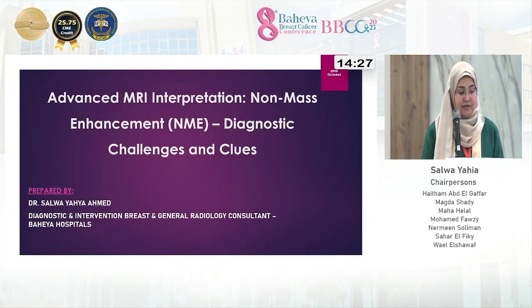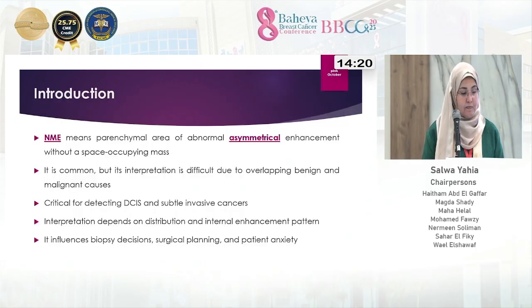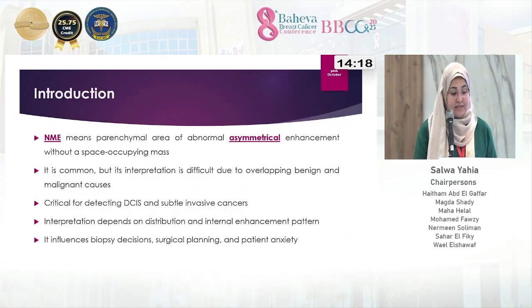Advanced MR interpretation, non-mass enhancement, diagnostic challenges and clues. Non-mass enhancement means parenchymal area of abnormal asymmetrical enhancement without a space-occupying lesion. It's common, but its interpretation is difficult due to the overlapping benign and malignant causes, critical for detecting DCIS and subtle invasive cancers. Interpretation depends on distribution and internal enhancement pattern. It influences biopsy decision, surgical planning, and patient anxiety.